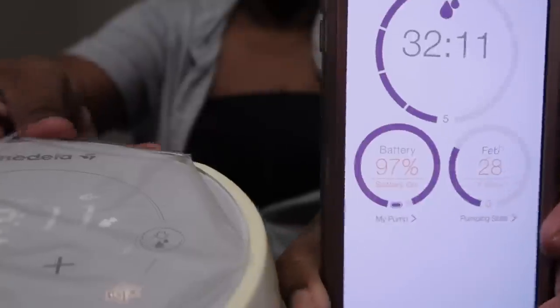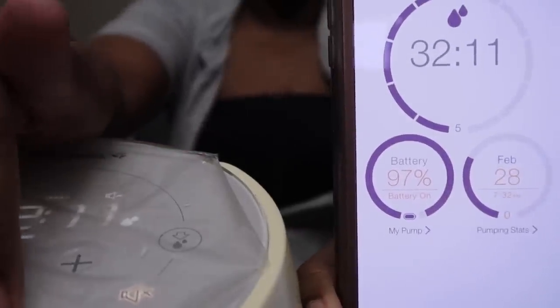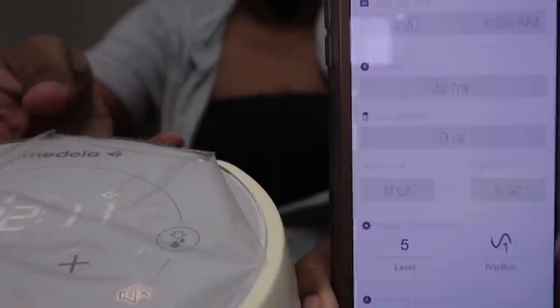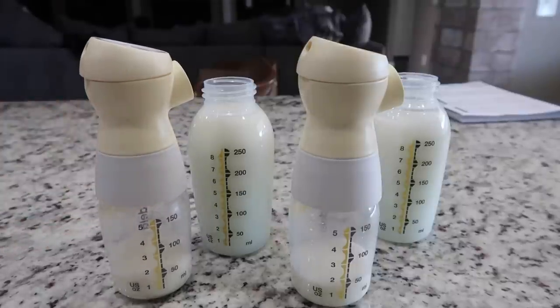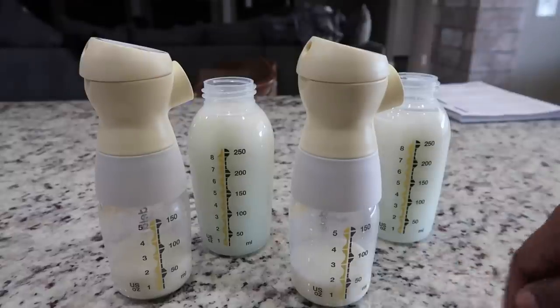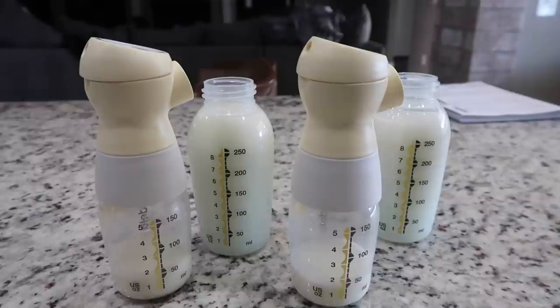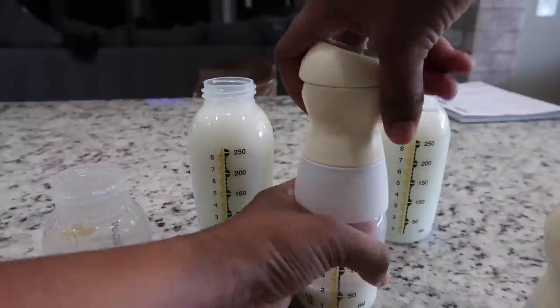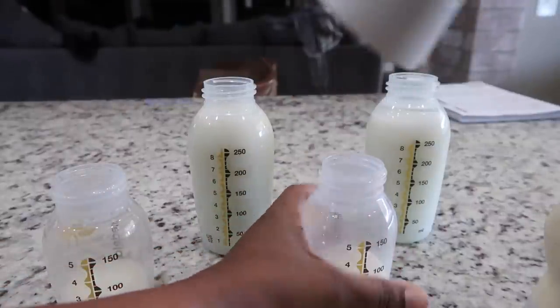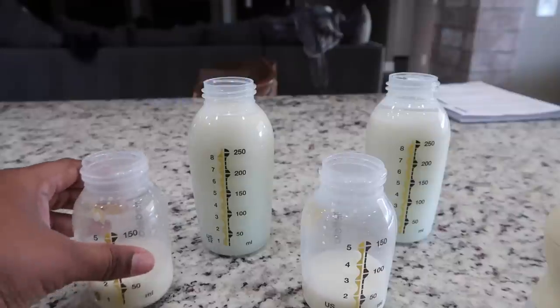I'm going to carefully remove the bottles and input my data into my app. This app is compatible with my Sonata, which is the type of pump I use. There are apps out there if you don't have the Sonata where you can enter in your data to keep up to date with how much milk you're expressing, which I highly recommend. For me it's something I do to get an overview of how much milk I was producing, especially in the beginning.